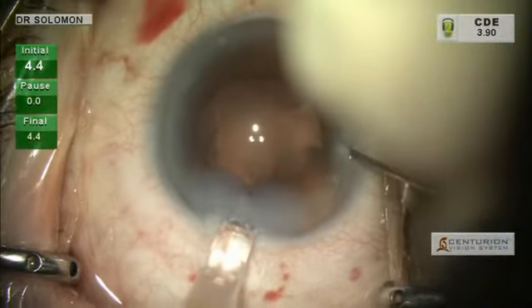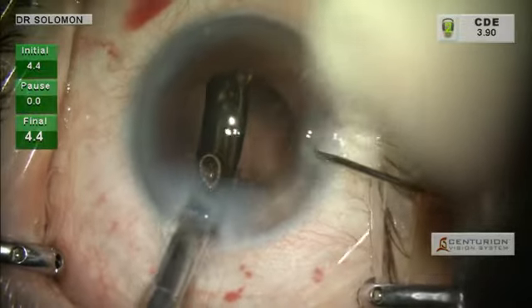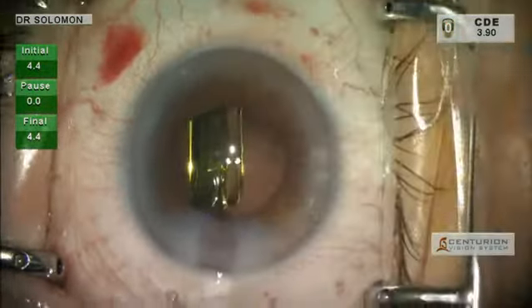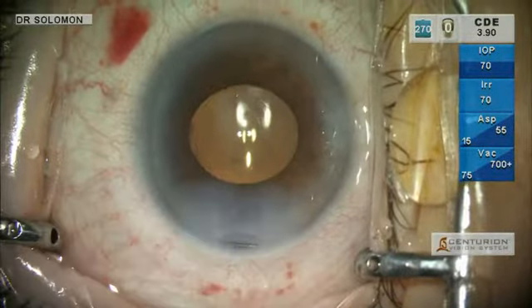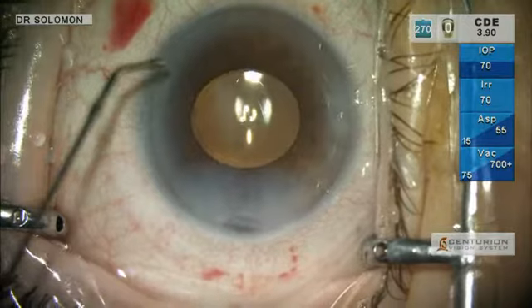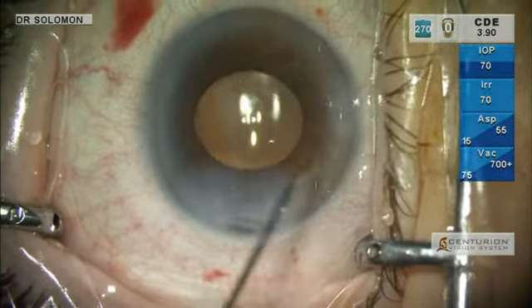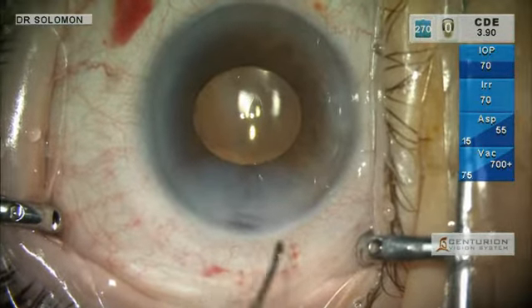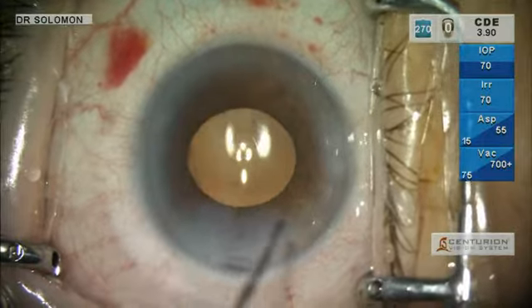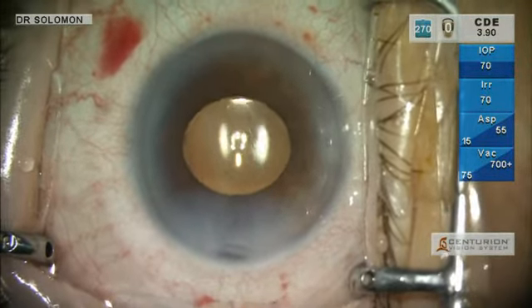I like to use my second instrument with the AutoSert to stabilize the eye and assist in delivering the lens right into the capsular bag. I've got my arcuate incisions placed with the Verion unit, my primary and secondary incisions, and I've taken into account my surgically induced astigmatism — all from the surgical plan. The capsulotomy is nicely centered, the lens is nicely centered, and we are done.